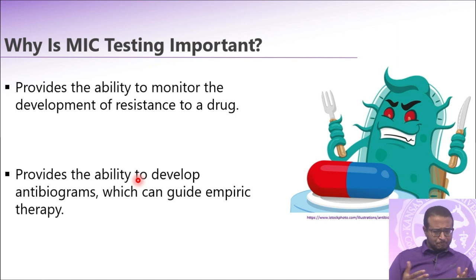Let's say a patient came to your clinic with an ear infection. You send an ear swab to the bacteriology section at K-State VDL. We grow Pseudomonas aeruginosa from there. And for drug X, the MIC was 1 microgram per mL, right? We use this drug, and the dog is getting better.